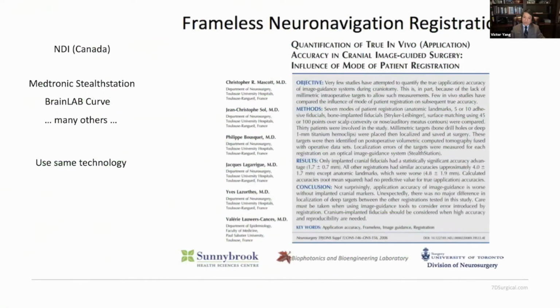We are not the first people to ask this question. And I'm sure in the audience, when you wonder about that in particular cases, there are other people who have studied this in quite some detail. One of the reasonable papers that we found is actually from France, and they have looked at the Medtronic StealthStation in terms of accuracy. From an engineering perspective, almost 90 to 95% of the global neural navigation equipment is actually manufactured in Canada. These are made by NDI, or Northern Digital Incorporated, and the Medtronic StealthStation, Brainlab Curve, and many other equipment essentially use the same backend technology.